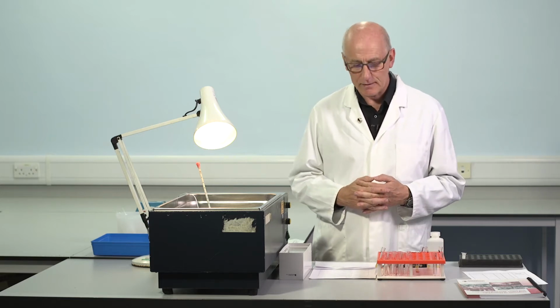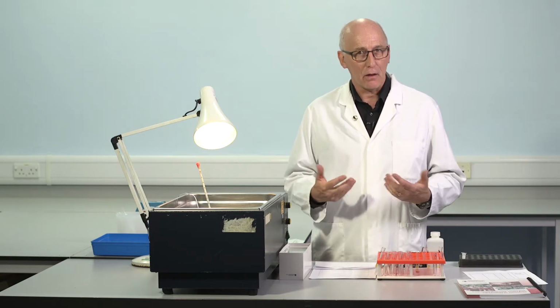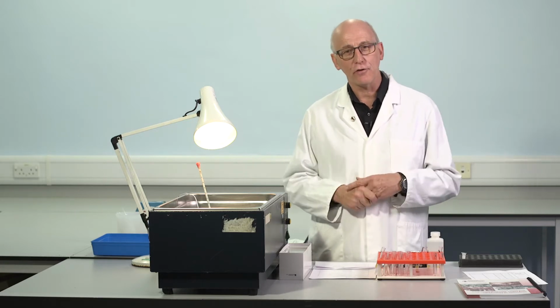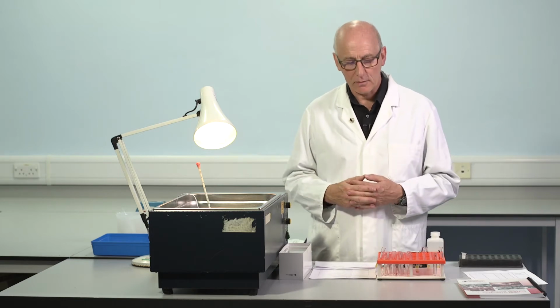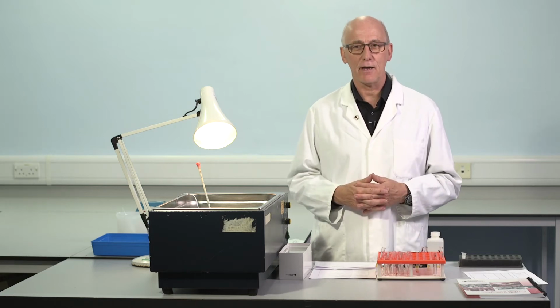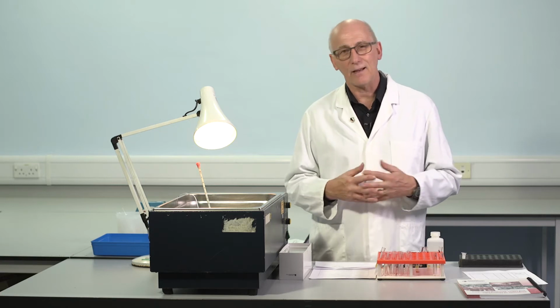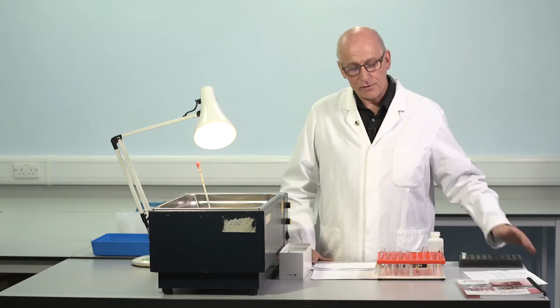If we have a plasma which is completely deficient in factor VIII, it will clot. I think you know that. The APTT depends on the reagent. Might be 100, 110 seconds, with another reagent 90, 100, maybe even with a different reagent 120, 130, but a grossly prolonged clotting time. In contrast, a normal sample containing a normal concentration of factor VIII, 25, 30 seconds. And we know that in between those two clotting times, the lower the level of factor VIII, the longer is the APTT. And so we make use of this fact.